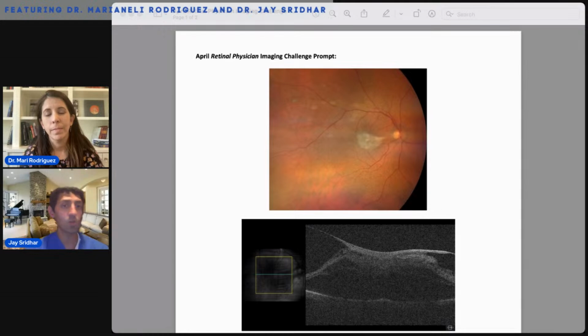If it's somebody, and I'm sure this patient had seen someone we referred to, who's seen a couple of people, they've thought about it, and they're like, I want to do it, then I think it's super reasonable at this point to take them to surgery. So a lot of it depends on the patient response, but I'm not sure how it goes up in New England. Well, I approach it very similar to you.